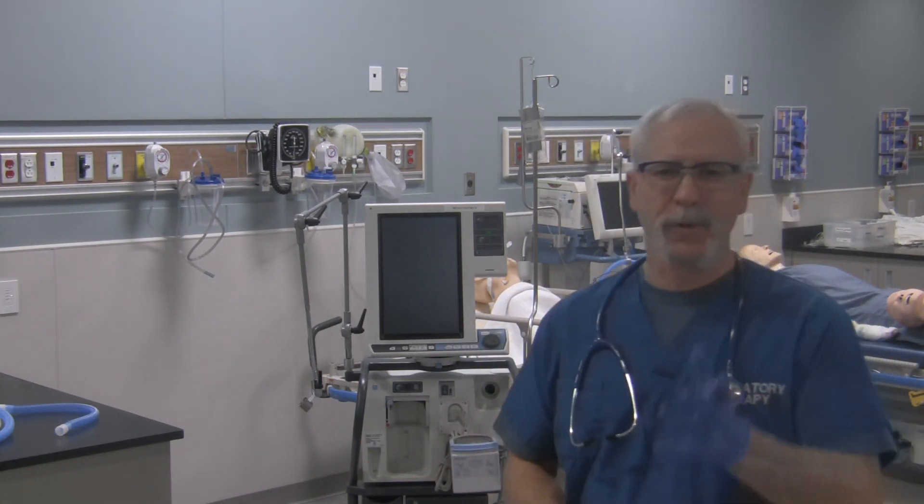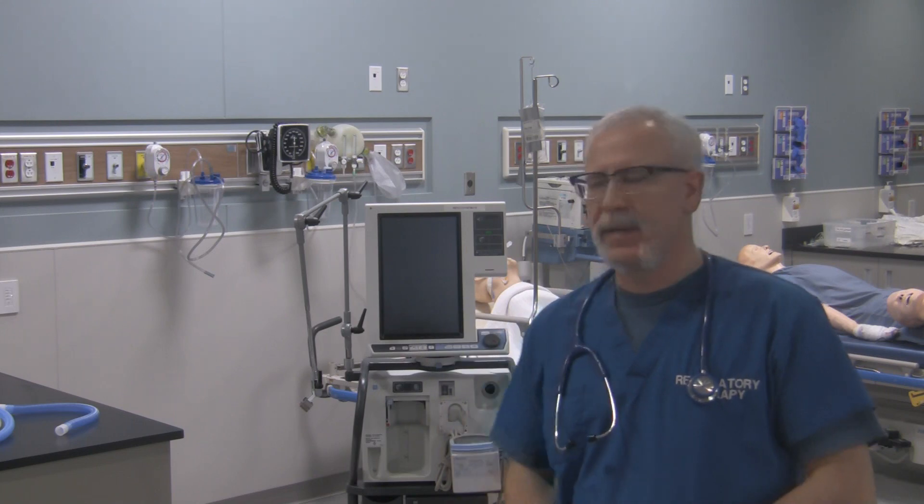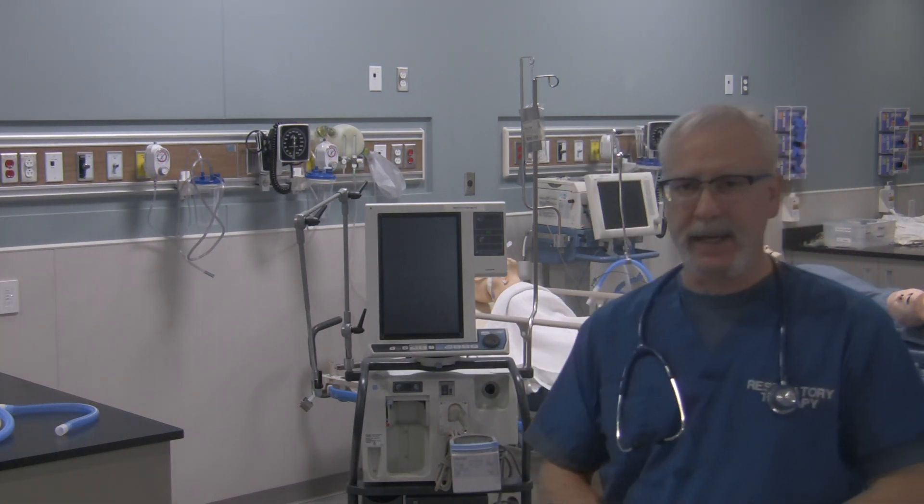Hi, it's me again, George here. Hope you're doing well. What we're going to do in this video is circuit this PB840 ventilator that I've got behind me.